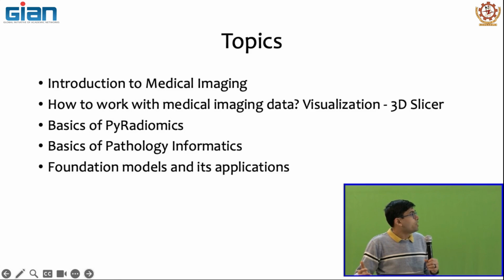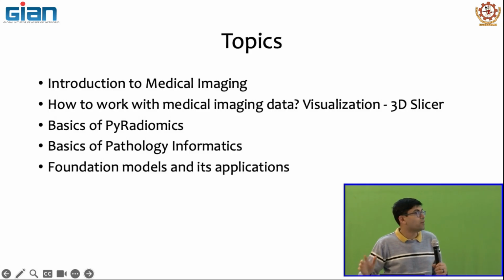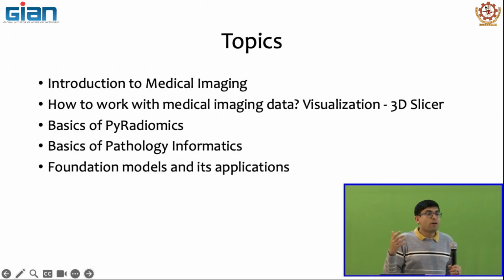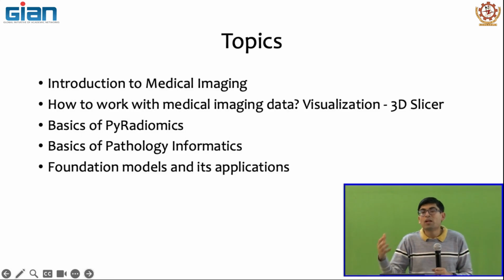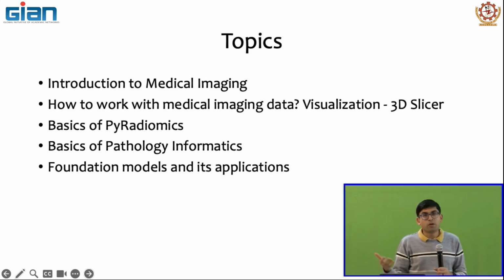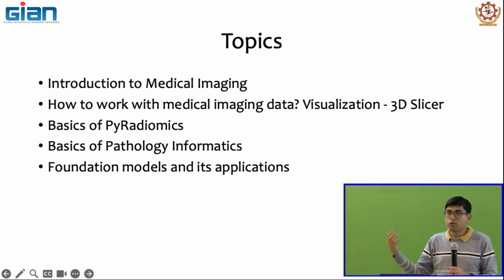I haven't really covered much of what foundation models are. Foundation models is essentially a new terminology, something that's thrown around nowadays. All that it means is models that have been trained on lots of data. So instead of having models that are very specific or very localized to your institution, maybe hundreds or thousands of data points, you have millions of data points that these models have been trained on. Those are the foundation models. And it's not necessary that if you download a foundation model off the shelf, it will work for your data.